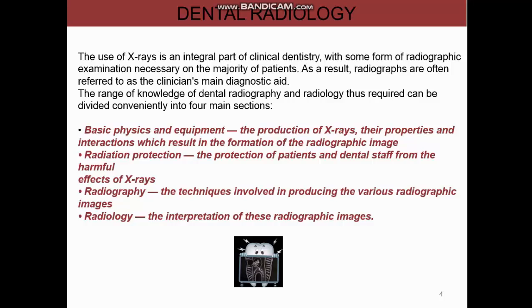X-rays are an integral part of clinical dentistry, with some form of radiographic examination necessary for the majority of patients. As a result, radiographs are often referred to as the clinician's main diagnostic aid. The range of knowledge of dental radiography and radiology thus required can be divided into four main sections.